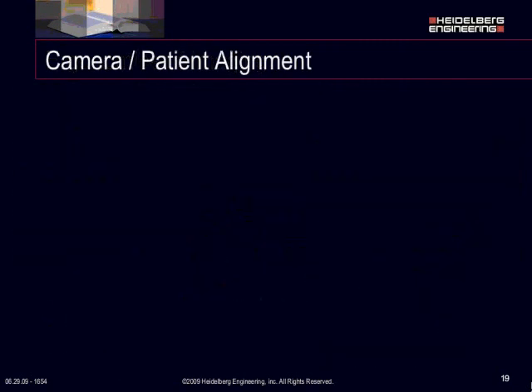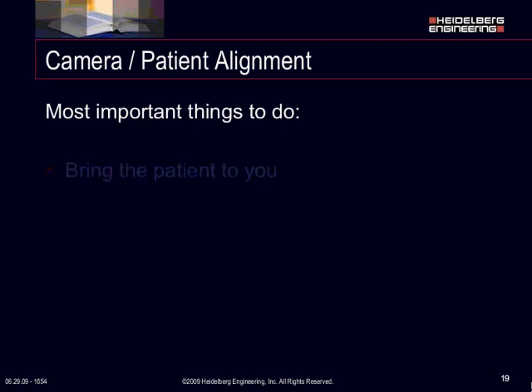Okay. Now, real important stuff, camera alignment. This is really about 90 to 95% of what you do, it's going to hinge on the camera alignment and the patient alignment. What you really want to do is bring the patient to you. You don't want to have to go to the patient.